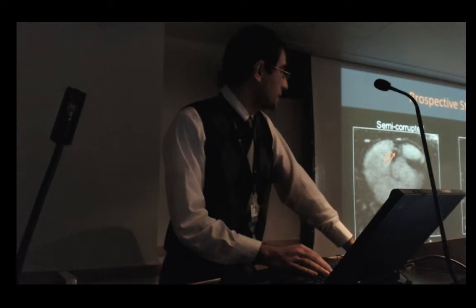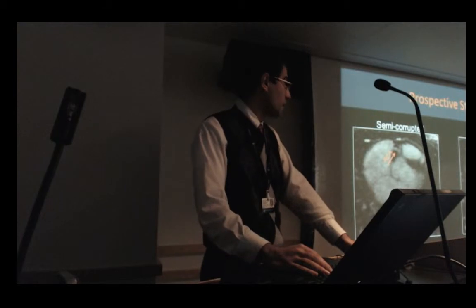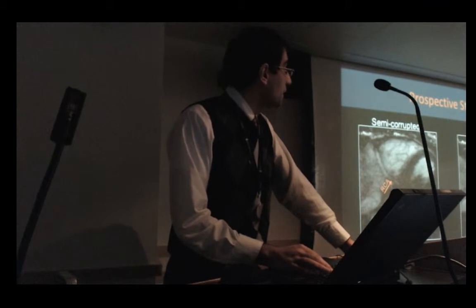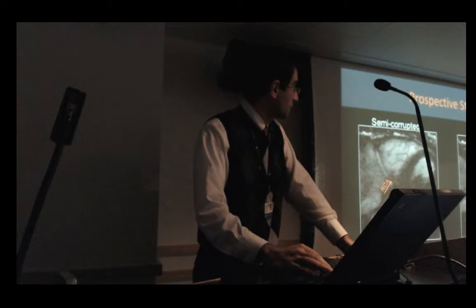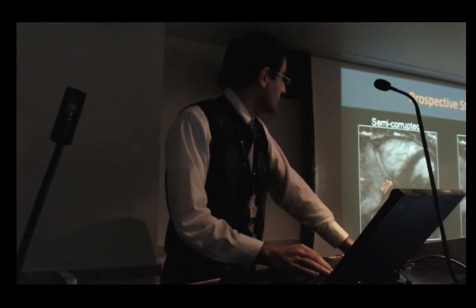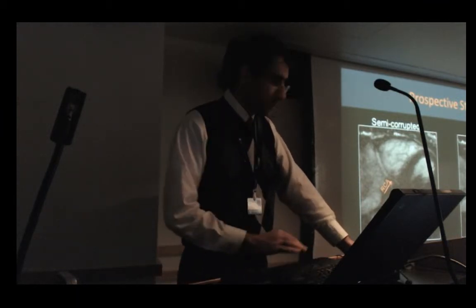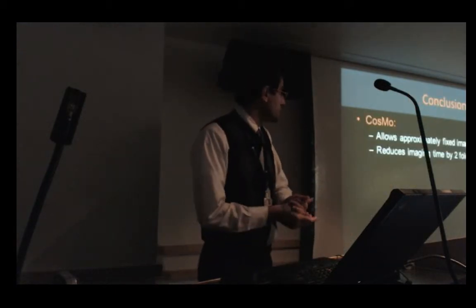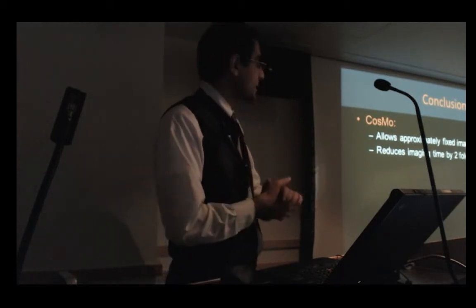You are looking at the axial image and the cross-section of the right coronary artery in the motion-corrupted data acquired by COSMO. This shows the compressed sensing image that we used to correct for the motion and estimate the motion-corrupted k-space lines. You can appreciate the cross-section of the right coronary artery is more delineated and sharper compared to the motion-corrupted one. The scan acquisition time for this volunteer was 10 minutes, but the projected acquisition time using the conventional technique would have been 23 minutes.